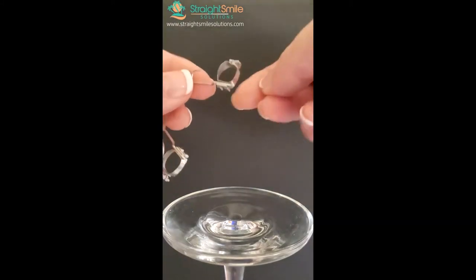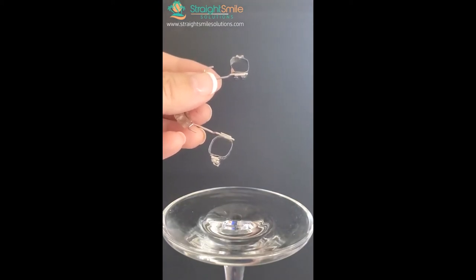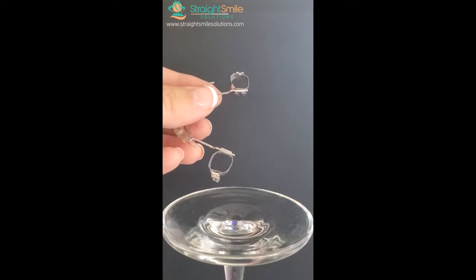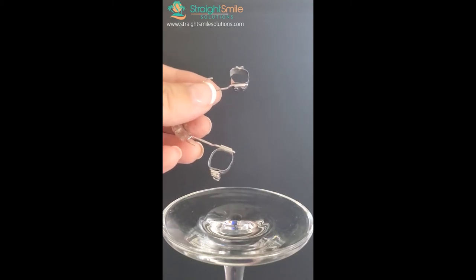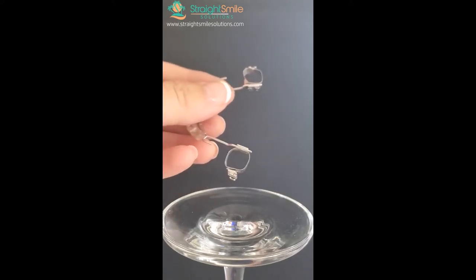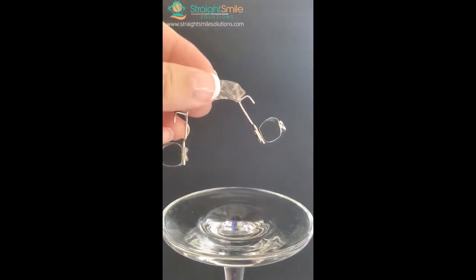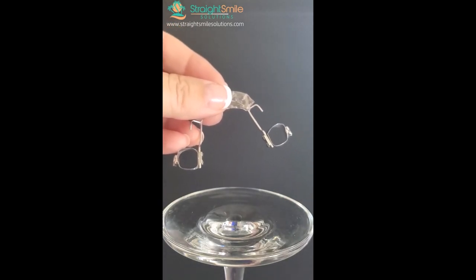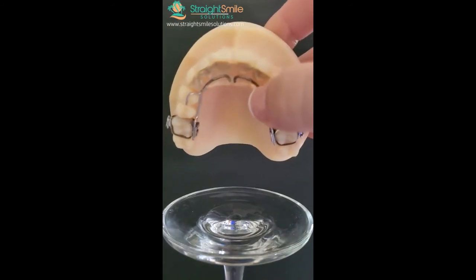When it comes back, put your band glue in a thin layer. My favorite band glue is by 3M Unitec — it's called Band-Lok, B-A-N-D-L-O-K — it comes in colors and when you load it and light cure it, it changes from purplish-blue to clear. If the fit is not very tight, I recommend using a Fuji-based modified glass ionomer because it's a little thicker, but I wouldn't use that unless you really need to because you'll have a hard time getting it off. Try it in first, make sure it fits, take it off, then cement it and light cure it.